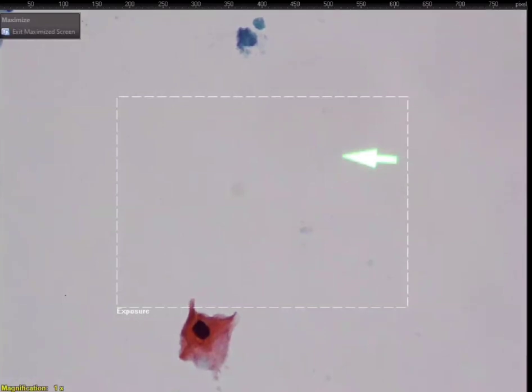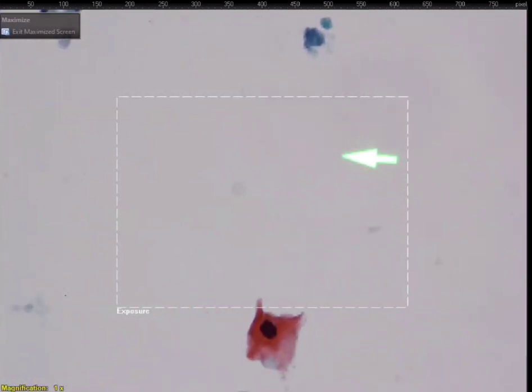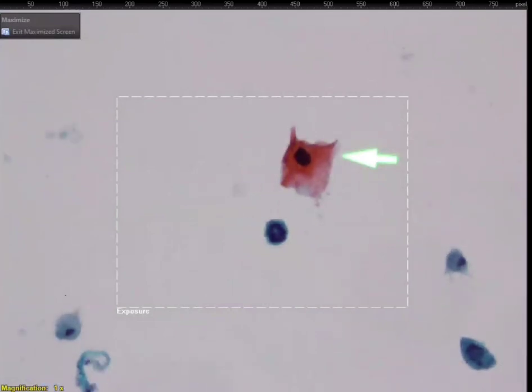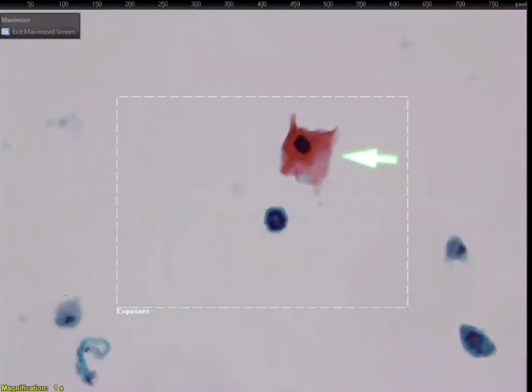Yes, that can be metastatic carcinoma to lymph nodes. Nasopharyngeal usually is a very high-grade squamous carcinoma. Or can it look like this? There are variants, might be non-keratinized or keratinized. So it's more of a high grade, usually, but it can present like this with keratin. Nasopharyngeal is another one that's usually Epstein-Barr virus positive as well, right? Okay, very good.